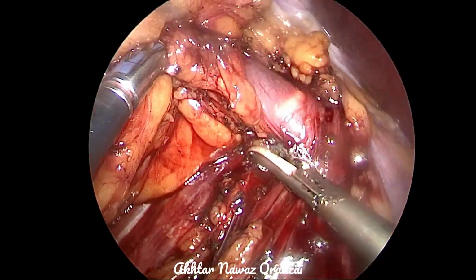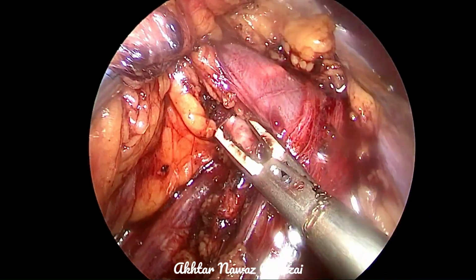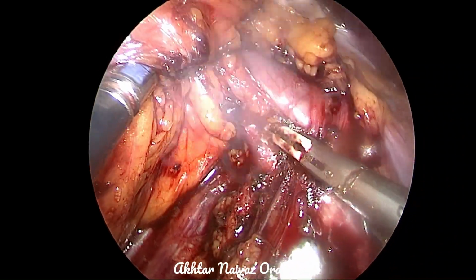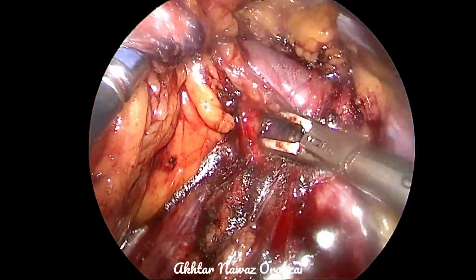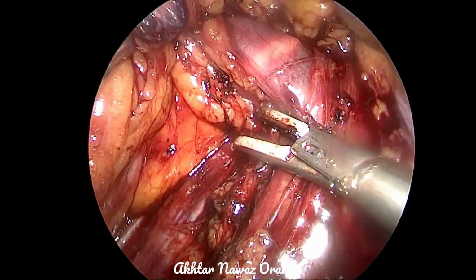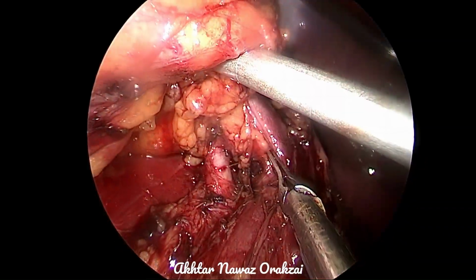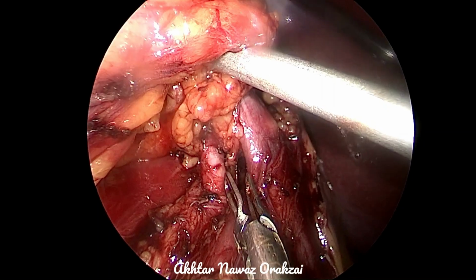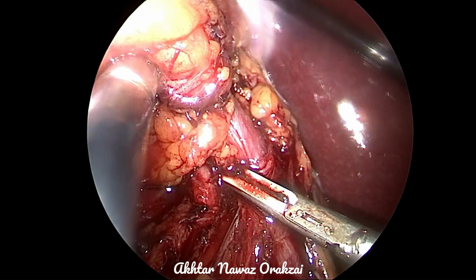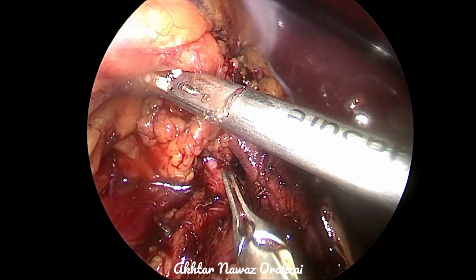So we are trying to stay away from that vein, not open it, and also dissect the artery nicely in order that a bulldog clamp can be applied. So we dissect between the artery and the vein to create a space which has now been created. Some bit of tissue needs to be removed because if the bulldog clamp is catching this tissue as well, the artery may not be completely closed, and then there will be bleeding and the procedure's quality will be compromised. Again, this tissue has been released.